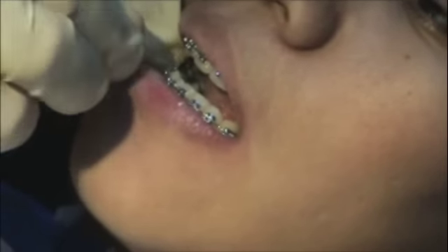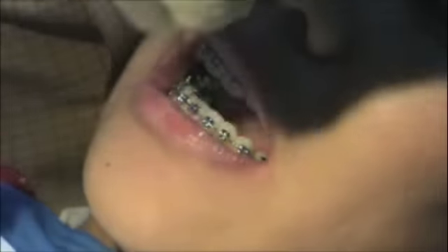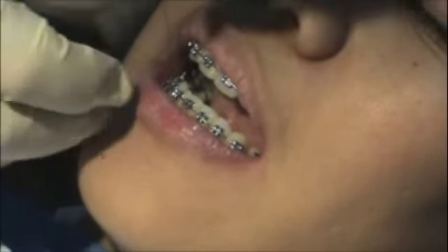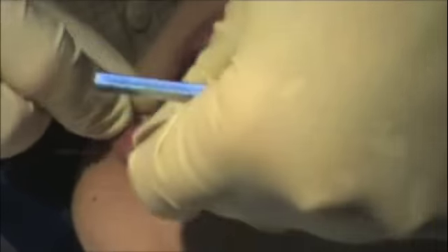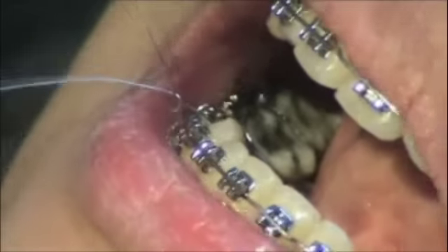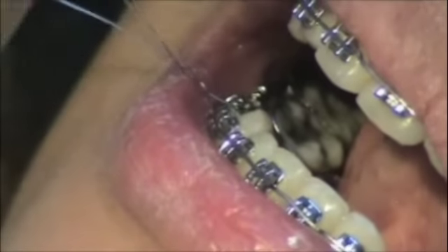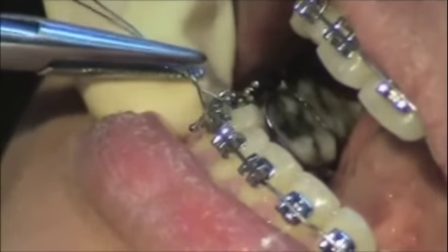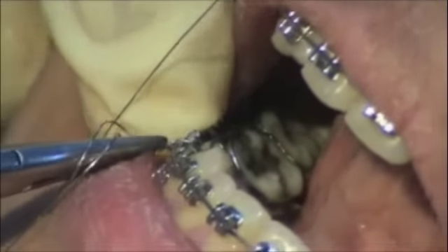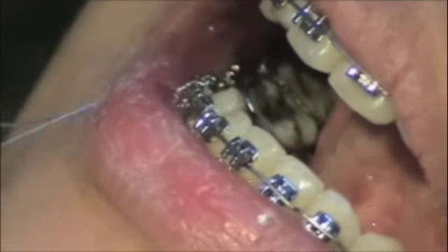Actually, I'm going to start the lacing, because we're going to lace this lower. So this is the five. I'm going to tighten that in there nice and tight. And now I'll just leave the end long and they can continue with the lacing. Thank you.